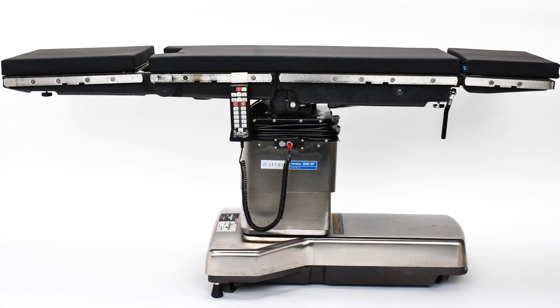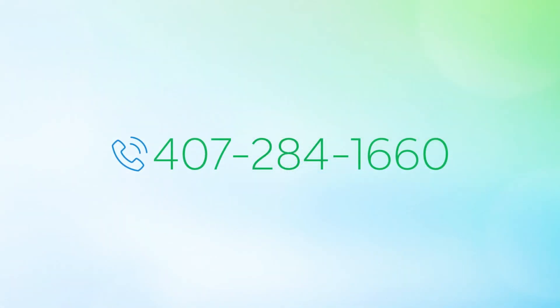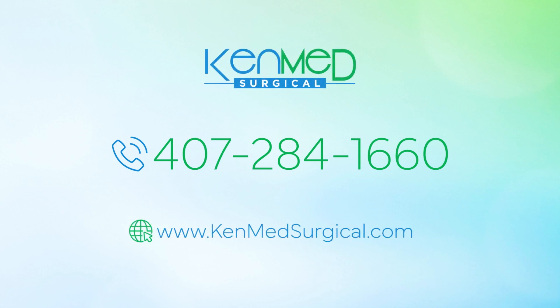Call today for pricing and availability on a refurbished, patient-ready AMSCO 3085 SP from KenMed Surgical.